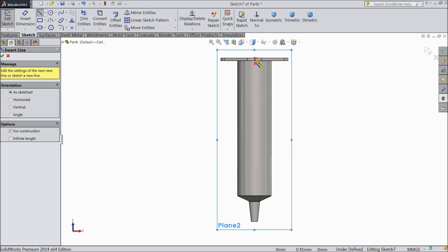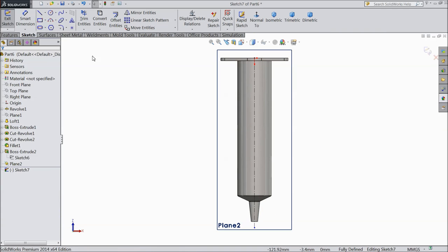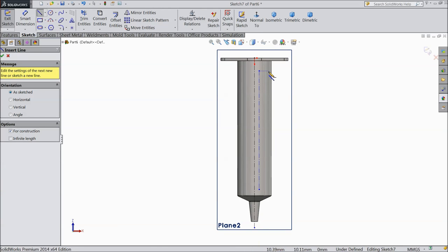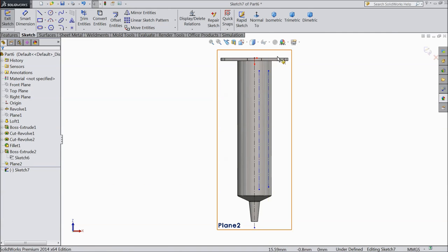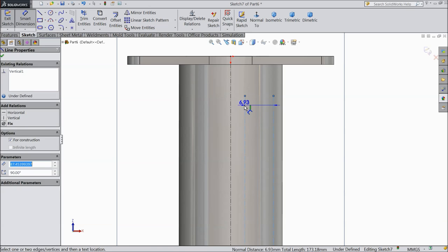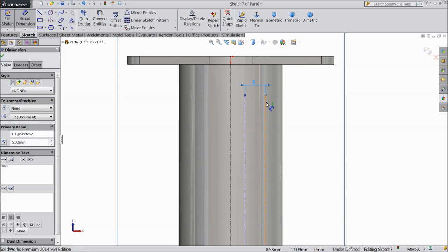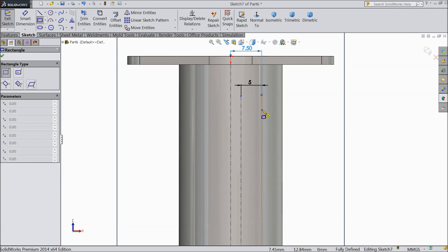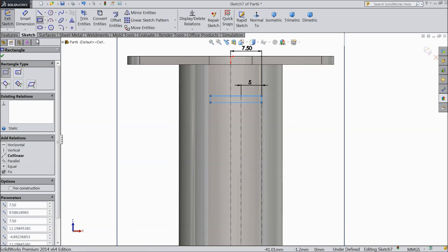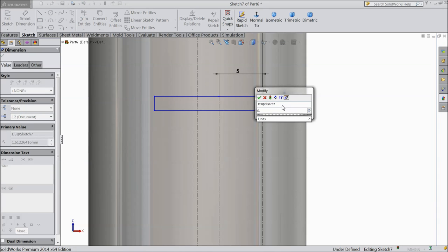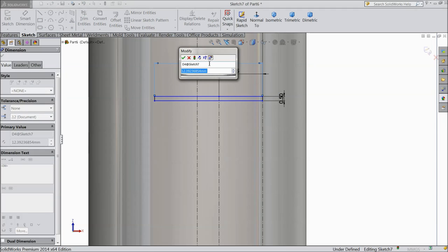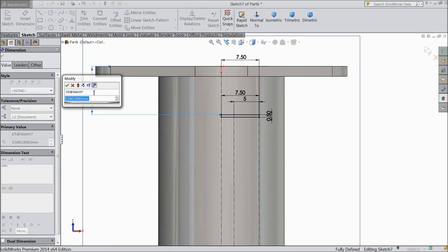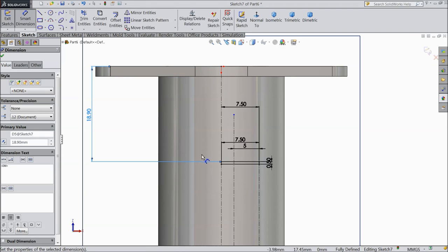Now draw a center line, then draw two lines. Assign the gap between these two lines. Assign the distance from here — 7.5mm. Now select rectangle and draw one rectangle. Assign dimensions: 0.5mm width, 7.5mm length, and the distance from here to the outer line 18.9mm.